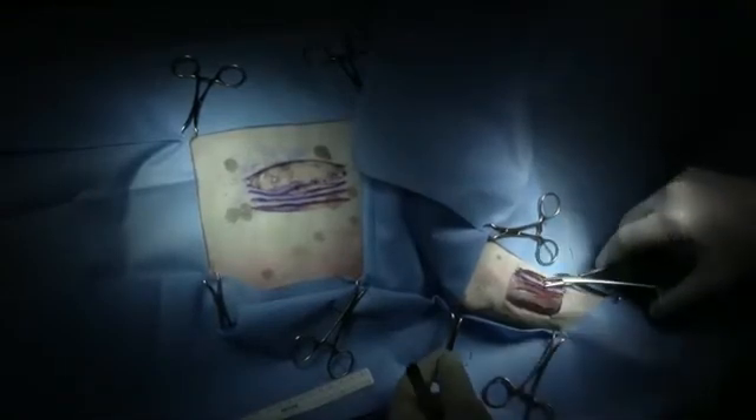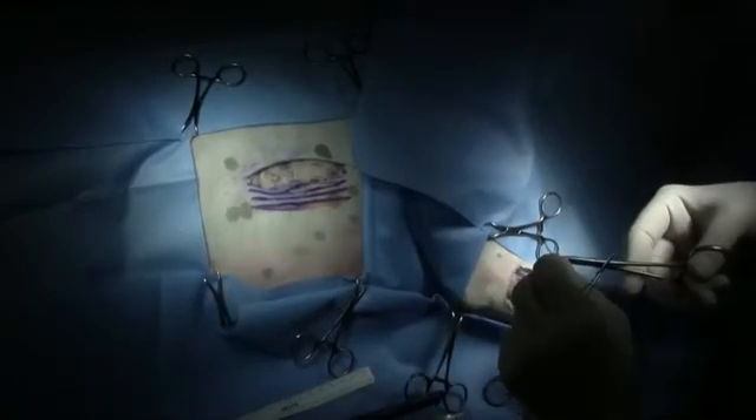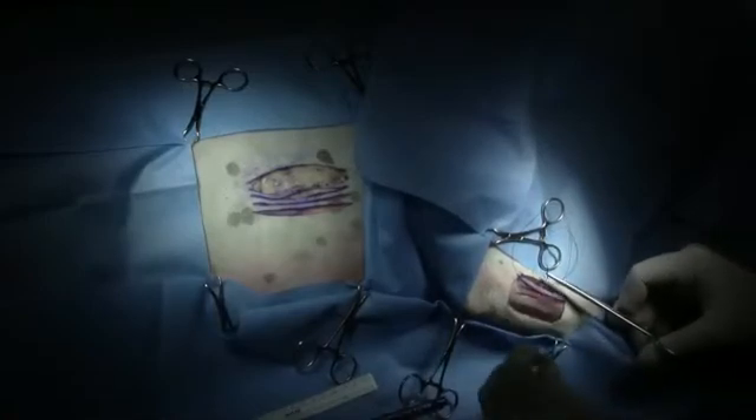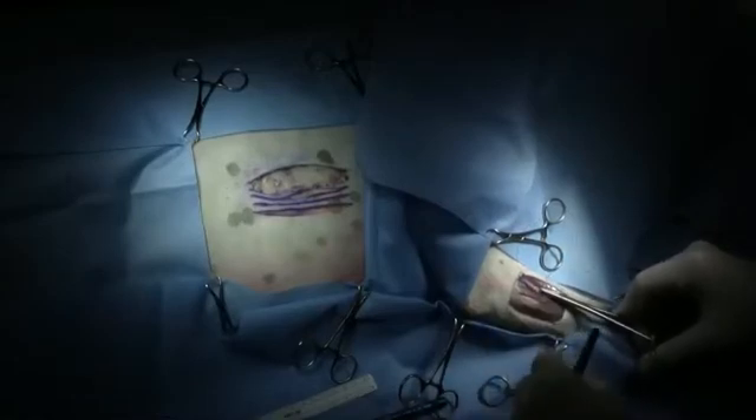We've got our first graft placed in the first groove that we made. Now if you feel it's necessary to place other sutures along the side of that graft, you can do so, but you have to do it carefully and you don't have to do it in a lot of places. Say if that wound ran over a joint or was in an area where you felt it needed some immobilization, you can take a bite in the edge of your granulation tissue. Be very careful, because granulation tissue is very friable and will tear easily. Pull your needle clear through and then come back through the edge of your graft. When you tie that suture, don't put a lot of tension on it — it's just an immobilization type of situation.